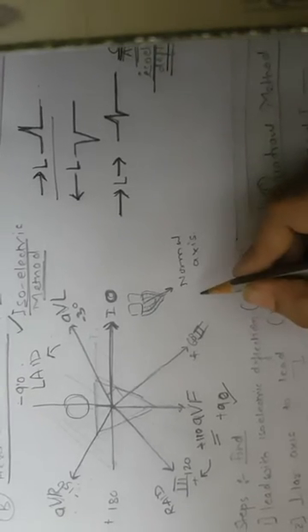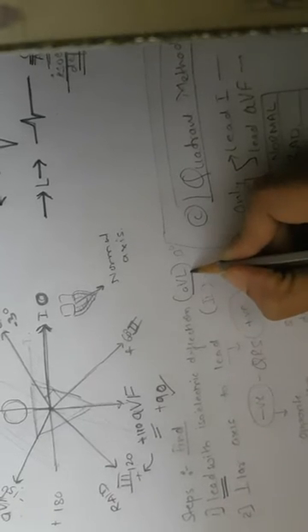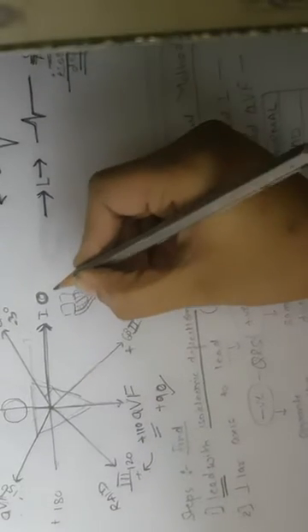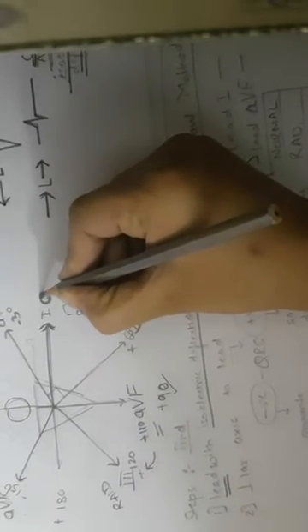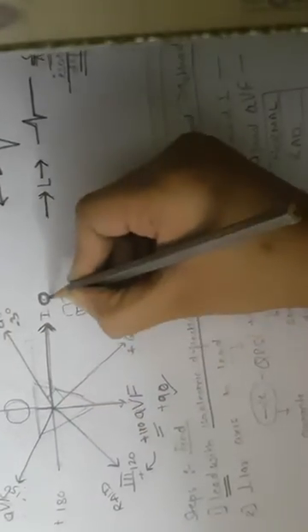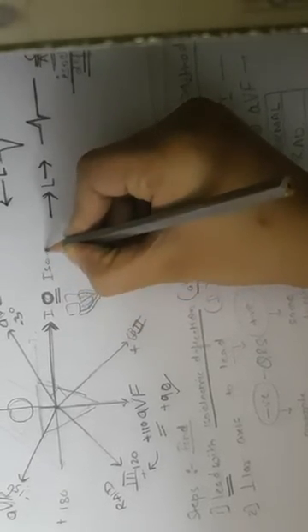Now, how do we find out an axis deviation, whether it is in the normal region, in the left direction or in the right direction? The first step is to find a lead which is having zero deflection, that is an isoelectric deflection. Lead 1 has the current coming and going away, so it has zero deflection.